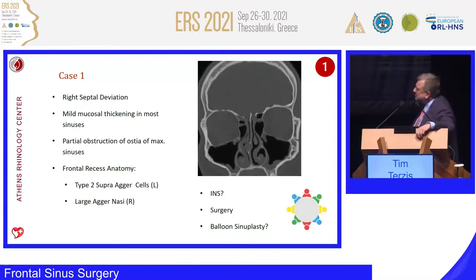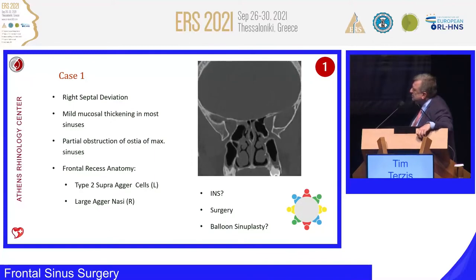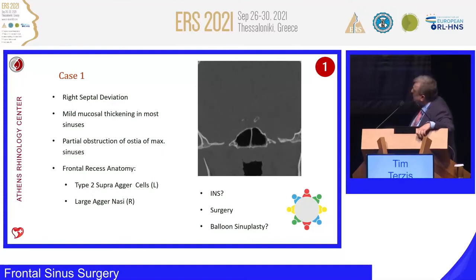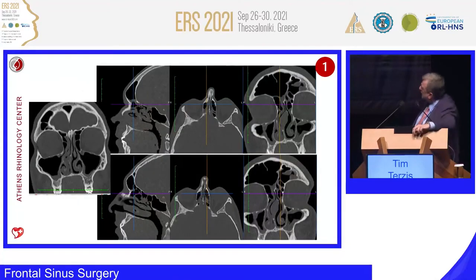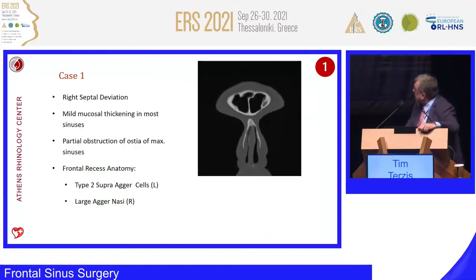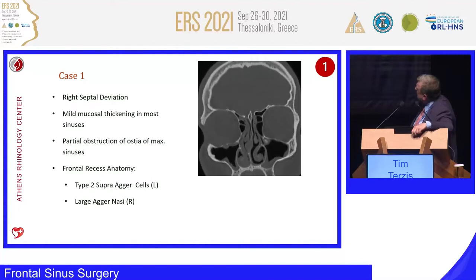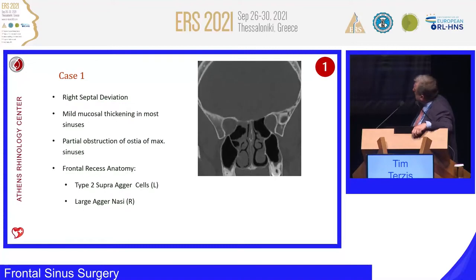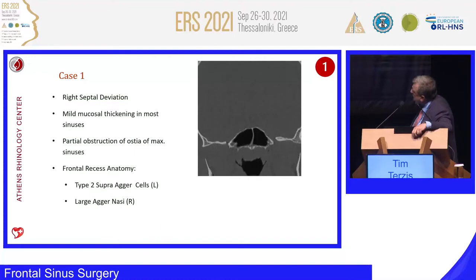It's a nice case. I would like to know about the CT scan. How old are the scans? Are there more than one scan available? Do you have maybe an MRI as well? That's the pictures I have here, and we have this film here of the coronal. No, they are nice. I mean, the demonstration is great. But that's the only one, and it's an actual CT scan, so it's not an old one.